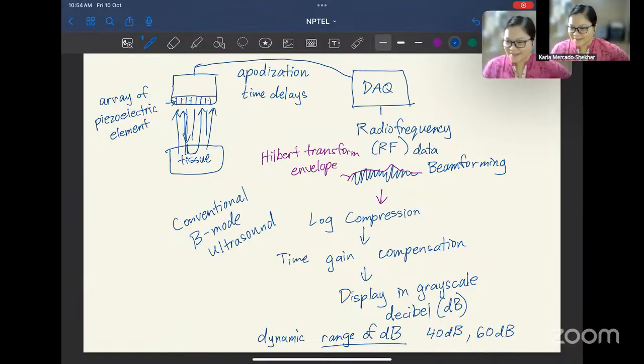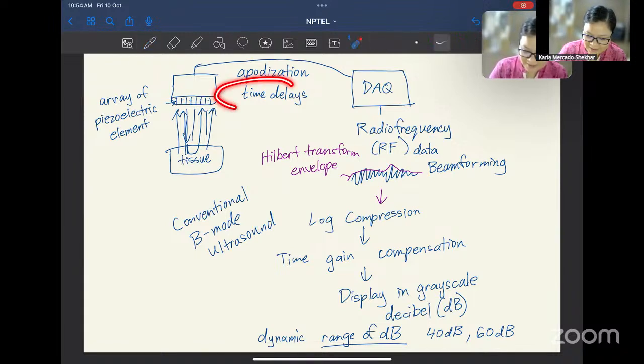Thanks, Manu. There is one other way, like for instance, time delays, right? The reason why these arrays are quite useful for imaging in the clinic is because they're fairly versatile. You can focus them at any depth. You can beamform any way you like. But if you want to hard code or ensure a fixed time delay, that can also be done with lenses.